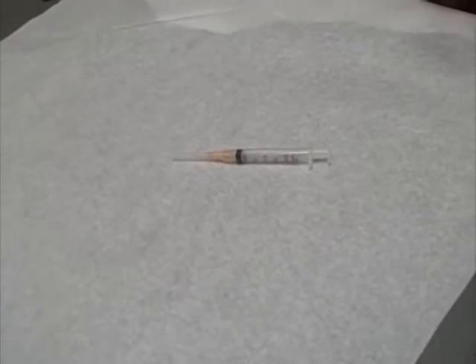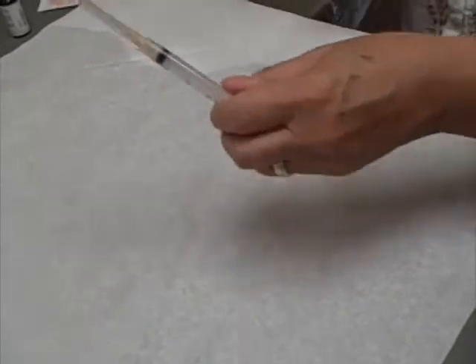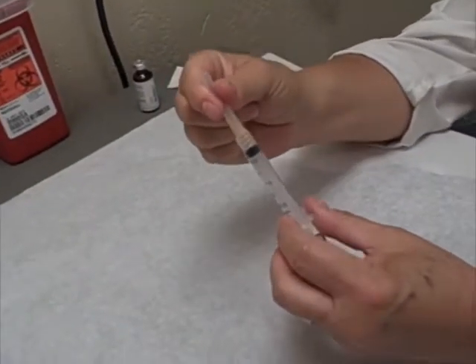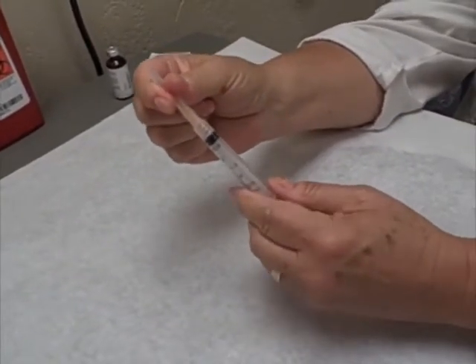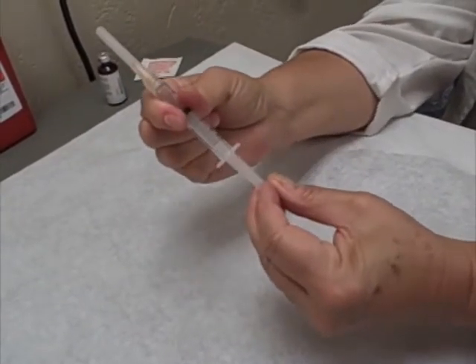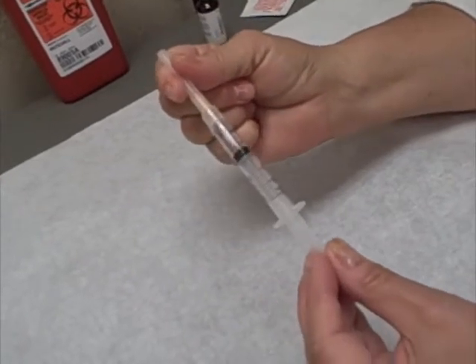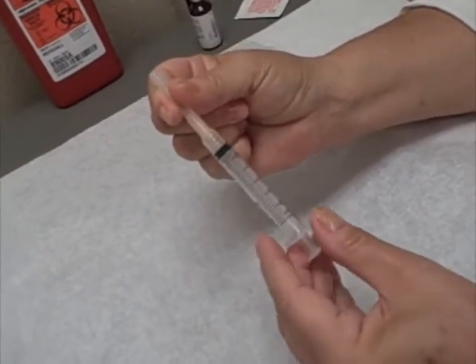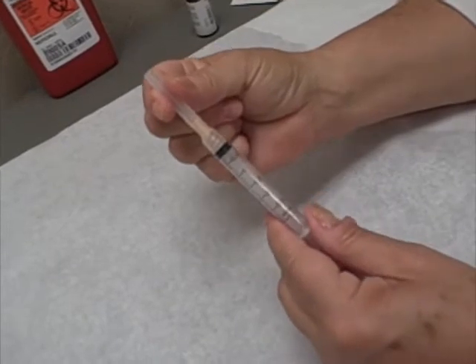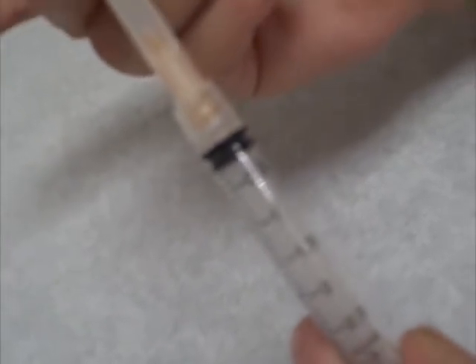Let's spend a moment looking closer at a syringe. A syringe consists of a needle, which we've already talked about tightening and pulling off the cap, the barrel, and the plunger, which moves up and down, and that's where the medication is drawn up and administered. On the side of the barrel of the syringe are markings in pharmaceutical terms that show how much of the medication needs to be drawn up.